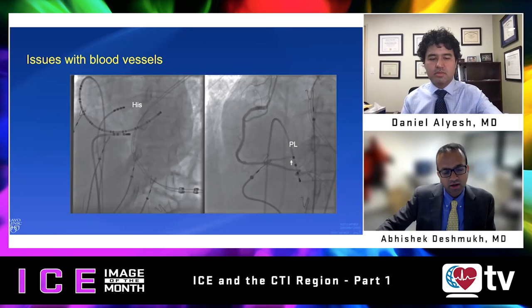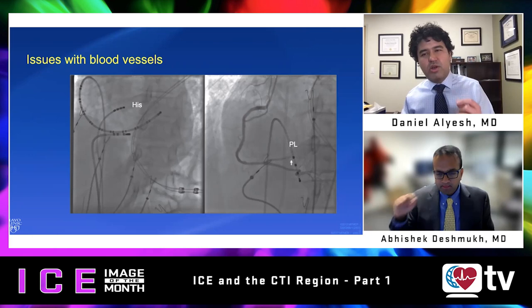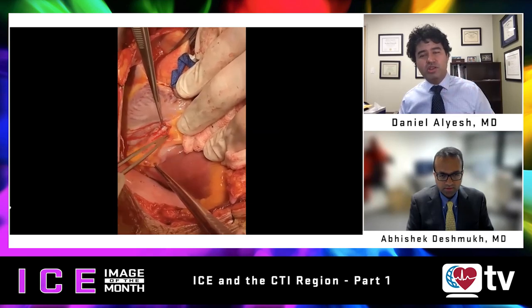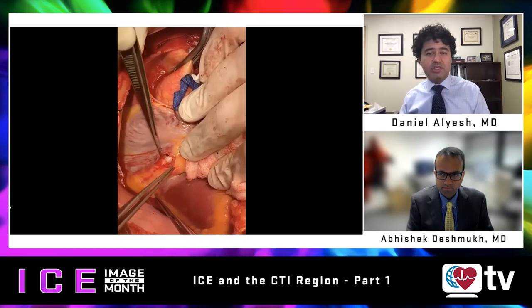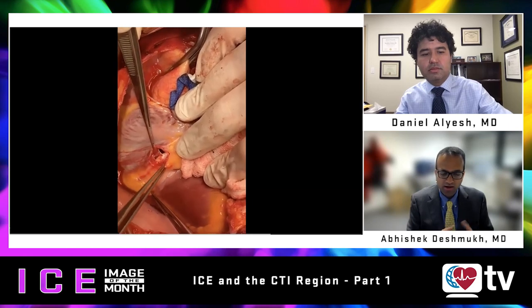This could also occur due to a ganglion effect and vasovagal reflex in that area — something to think about. The course of the right coronary artery is very well visualized on ICE. This video came from Twitter, where they were performing bypass surgery and pointing out a very endocardial course of the RCA, which can vary significantly. Knowing the course of the right coronary artery as it applies to the CTI region can be very helpful.